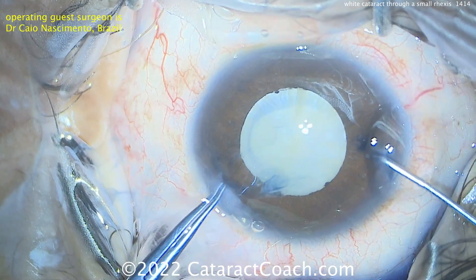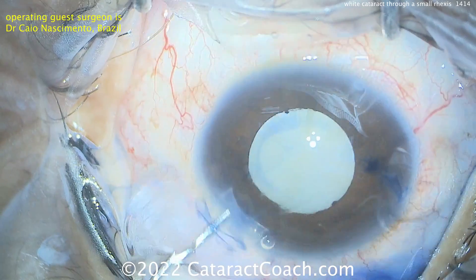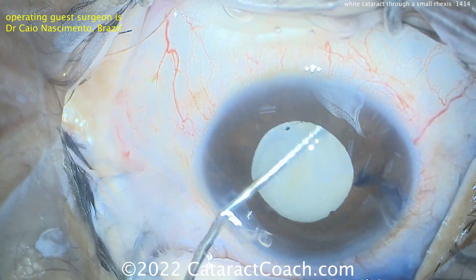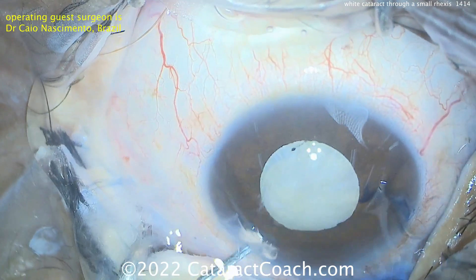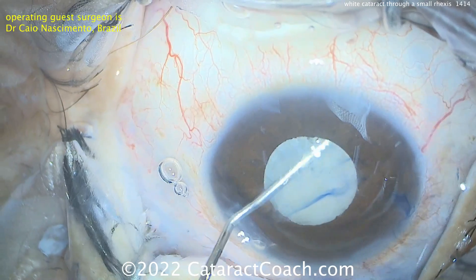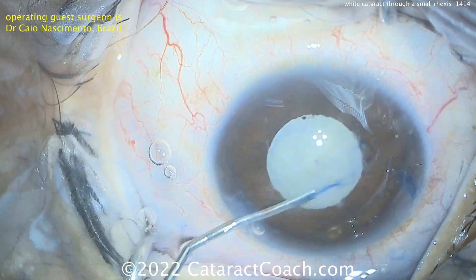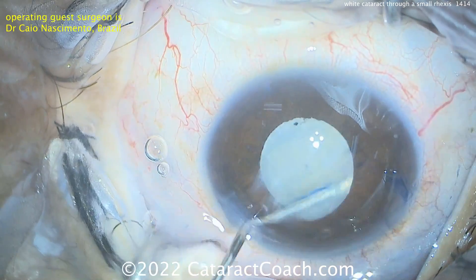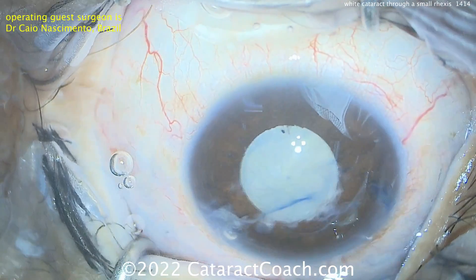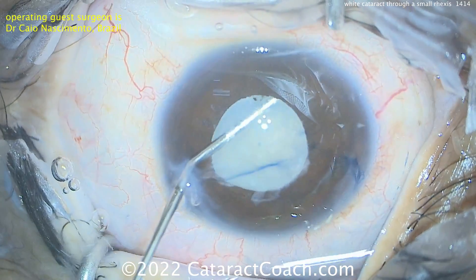He's going to end up with about a four millimeter capsulorhexis. That looks pretty good — nice and intact. That spiral-out technique, very nicely done. So a little balanced salt solution going inside, maybe a little hydrodissection. The nucleus appears to spin pretty freely, probably because of all that liquefied lens cortex. Just sweeping it around — this nucleus shouldn't have too much density, should be fairly easy to remove. A little more hydrodissection and rotation of that lens nucleus. This thing is rotating pretty freely.